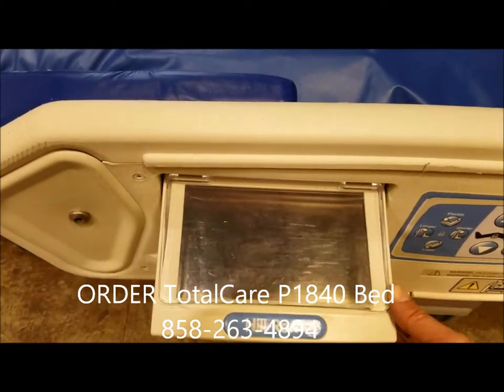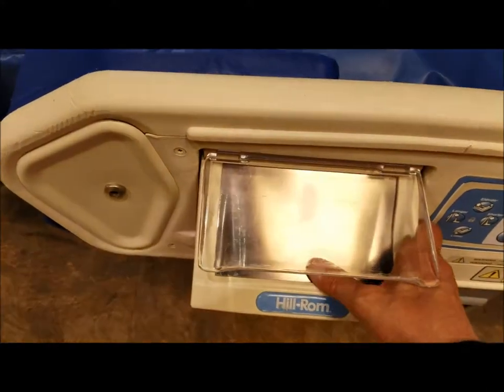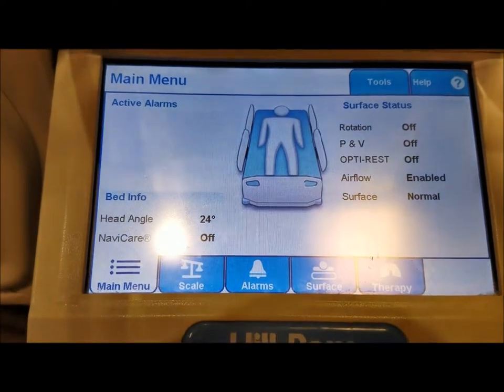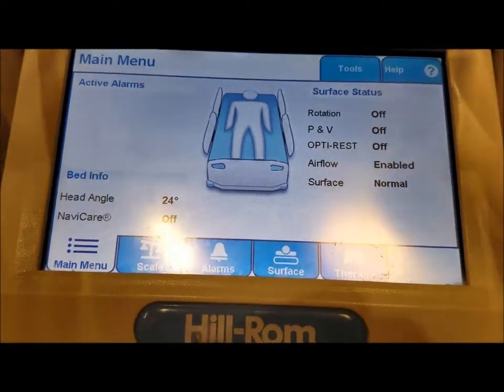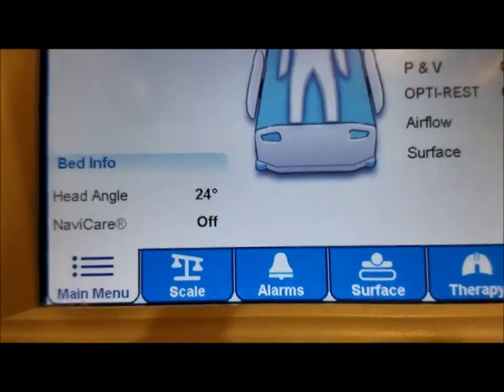And we've got the touchscreen control right here. So we turn this on, and this is going to allow you to basically control the functionality of the hospital bed. You've got different settings. We'll kind of just go through those real briefly.